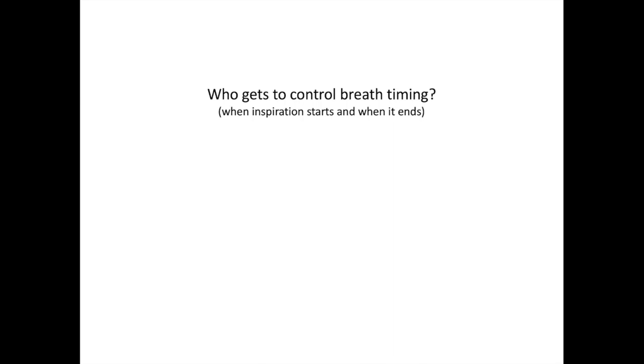So we went through the ventilatory cycle, and we talked about inspiration and expiration, and we said that expiration was passive, meaning it depends on the patient's own mechanics. The ventilator doesn't suck the air back out of them, it just lets the patient's chest wall and lungs relax to push the air back out. So a way to think about it is to say that a mechanical ventilator is a provider of inspiration, or it assists a patient with inspiration.